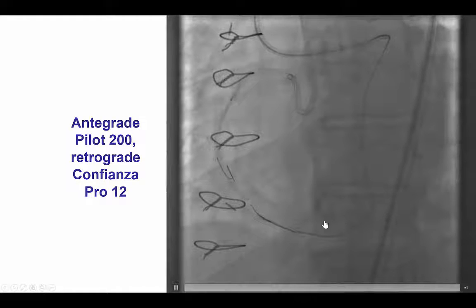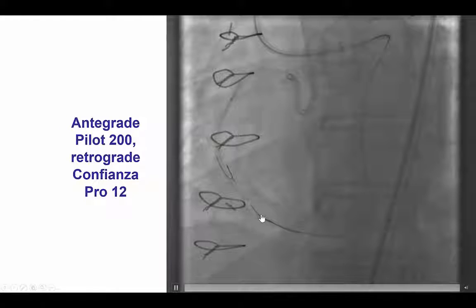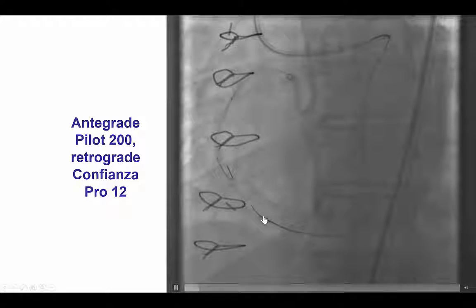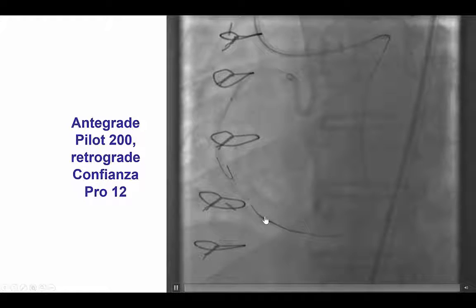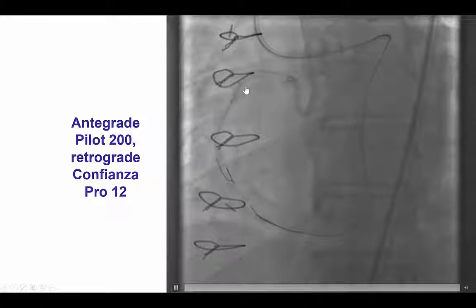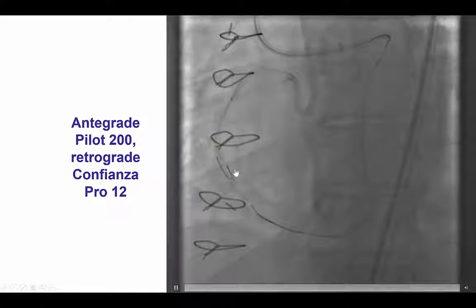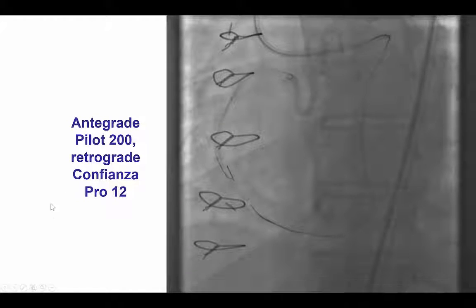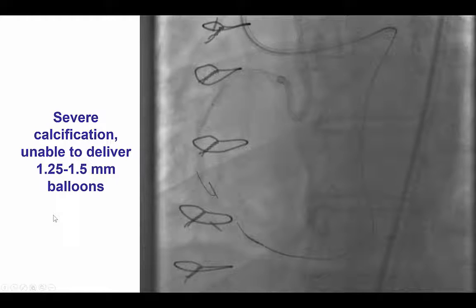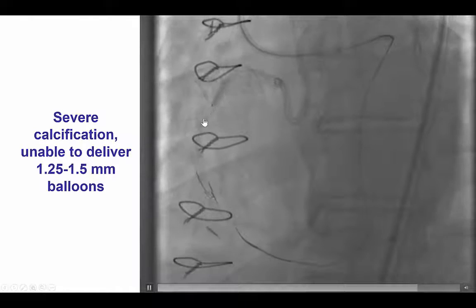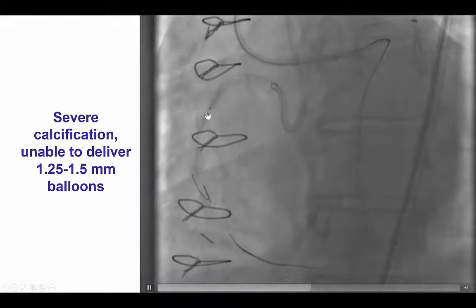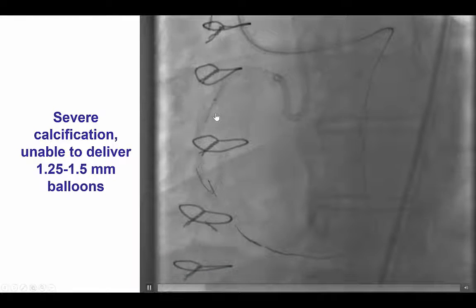We were then able to advance the retrograde Corsair all the way to the distal RCA, but then had significant difficulty advancing past the bifurcation on the distal cap, which is a common problem with such lesions. We were able to advance an antegrade wire to the distal RCA, but had significant difficulty advancing a balloon through the mid part of the vessel, likely because of the severe calcification.